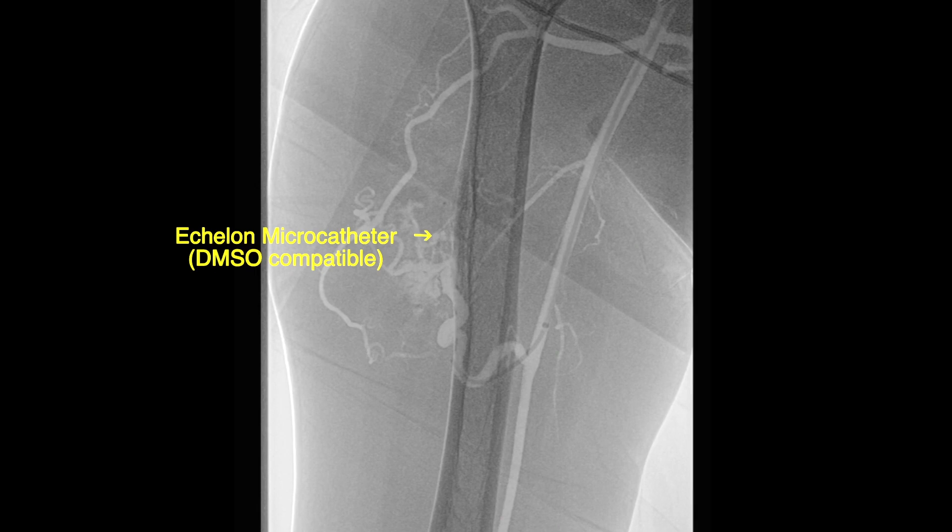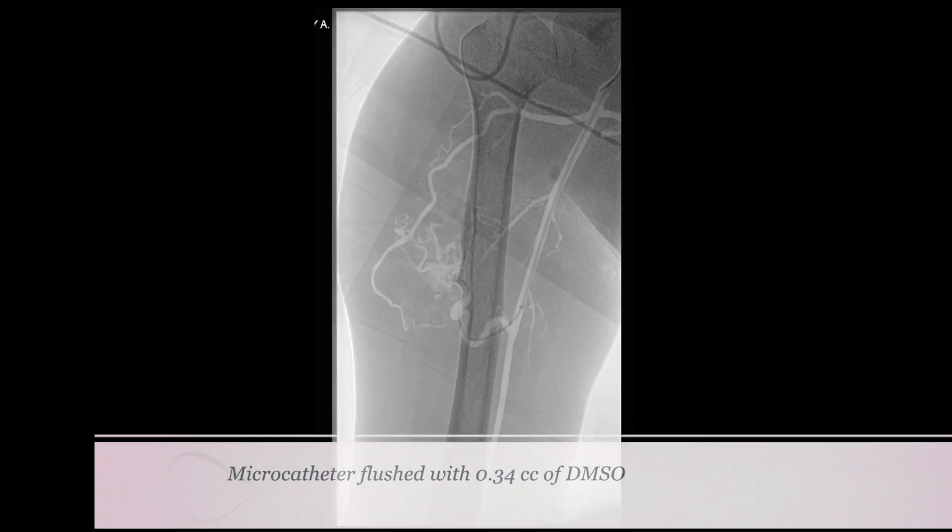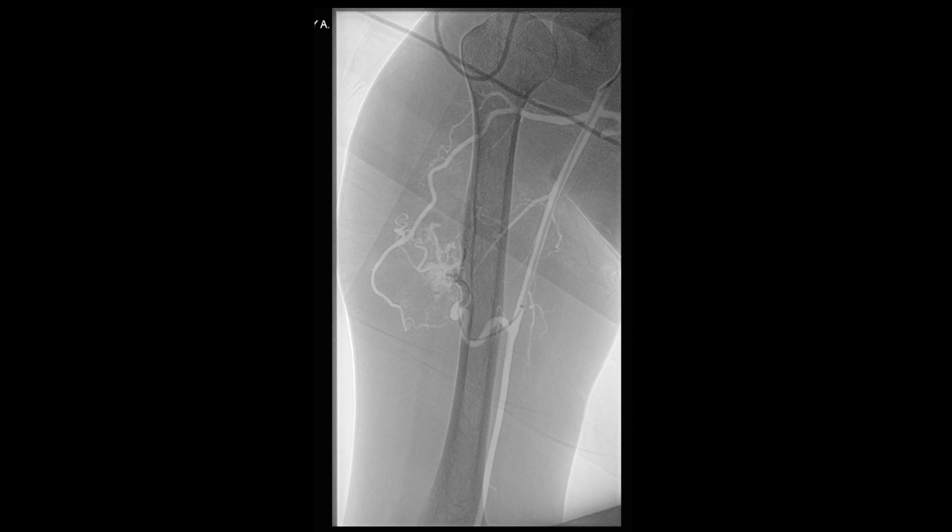This is an Echelon micro catheter, which is DMSO compatible. This was followed by performing an angiogram through this micro catheter and visualizing the flow through the arteriovenous malformation. Prior to performing onyx embolization, the micro catheter is flushed with 0.34 cc of DMSO.